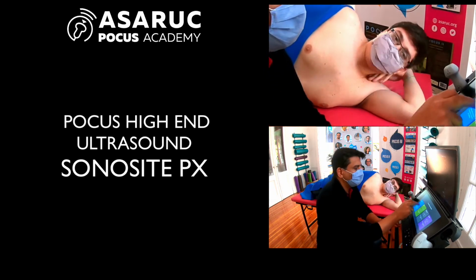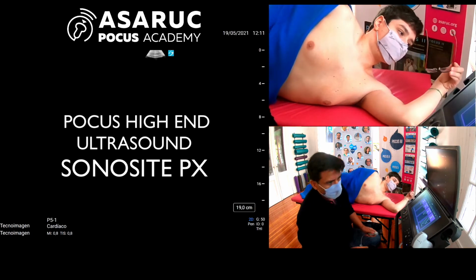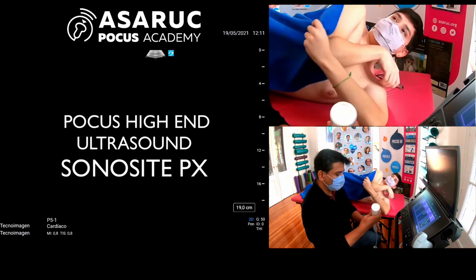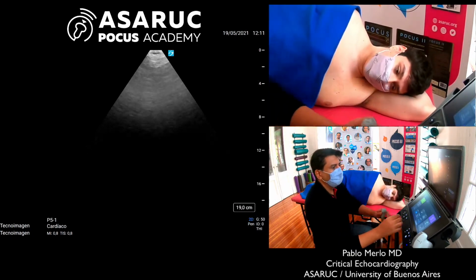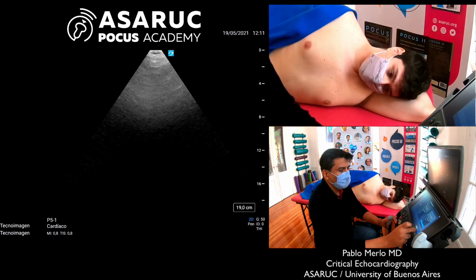Good morning, colleagues. Today, you're going to see a hands-on imaging test recorded on video. We'll perform it with a high-end Sonosite PX Pocus device. We'll look at left ventricle systolic function indices.